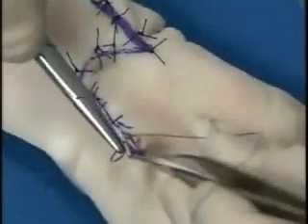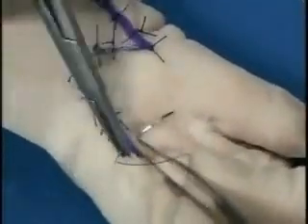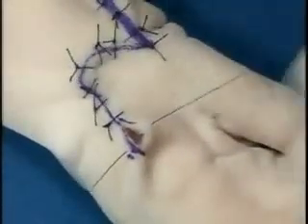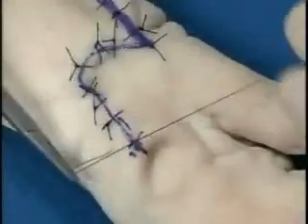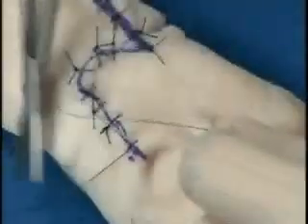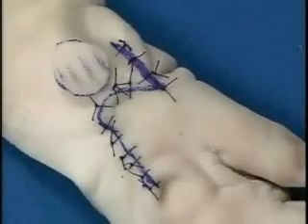And now the sutures, one or two may be placed depending upon the amount of tissue that needs to be closed. The sutures are now placed to complete the closure of the wound. Here we see the excision of the circular defect and the closure with the note flap.